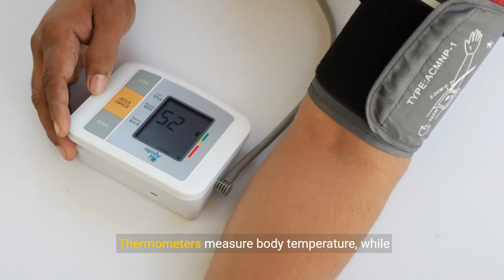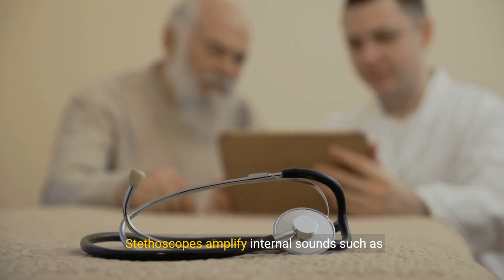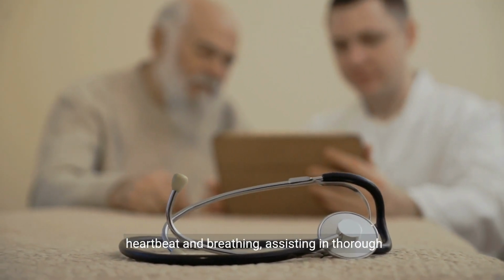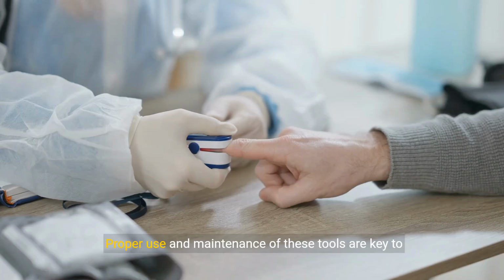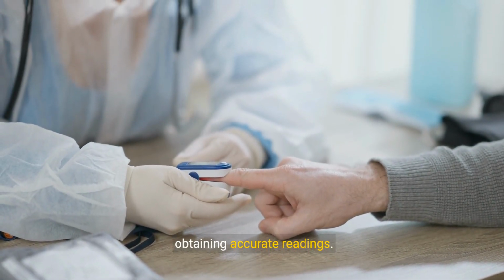Thermometers measure body temperature, while sphygmomanometers gauge blood pressure. Stethoscopes amplify internal sounds such as heartbeat and breathing, assisting in thorough assessments. Pulse oximeters measure the oxygen saturation in a patient's blood. Proper use and maintenance of these tools are key to obtaining accurate readings.